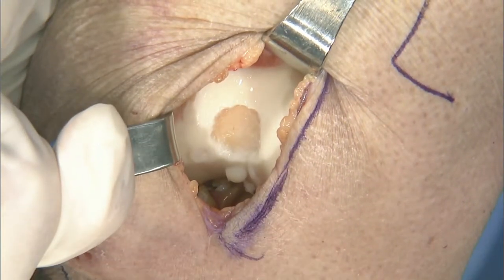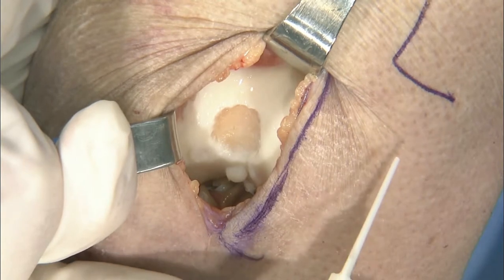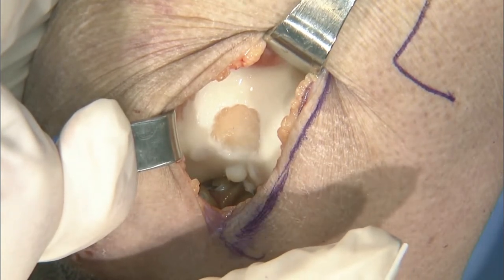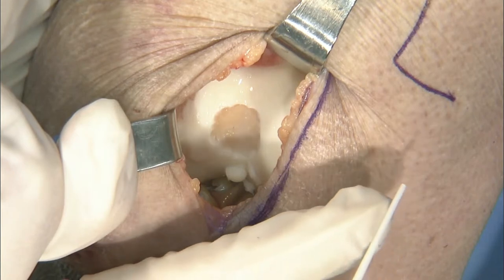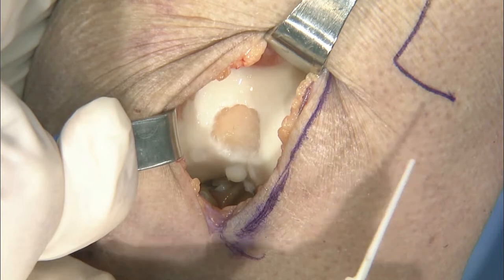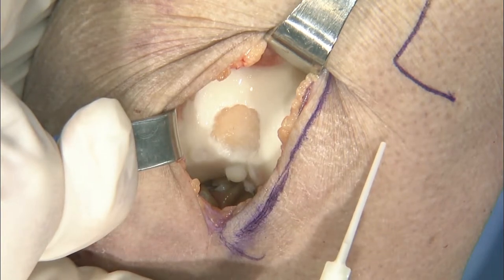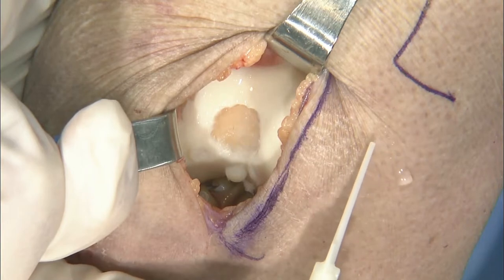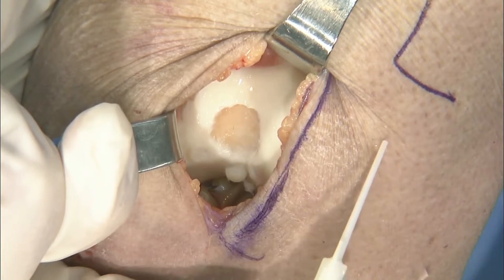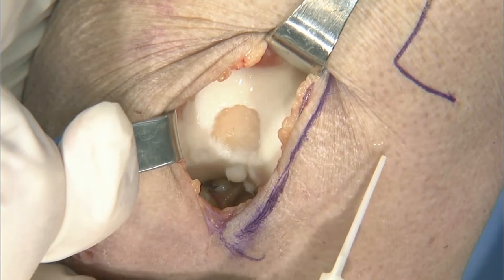What I'm going to do is test it out. I'm going to go to a part lower on the knee, because once you have this open, you can sometimes get a hard part where it can harden at the tip of that. And the harder you push, it can all come out in one quick big gush. So I will come in here and start injecting, and get it to the point where I say, okay, I have a feel for this. Each fibrin glue is a little bit different as well. Some of them are runnier, some of them are thicker.